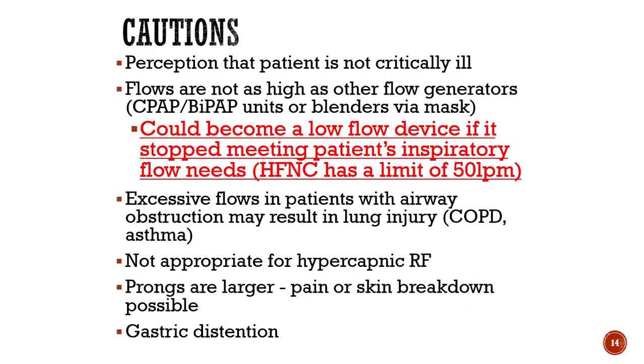Whenever you have patients that are needing high flow blender devices, you always want to be doing some sort of supplementary treatment, hyperinflation, mucus clearance, whatever the case may be. This is not going to cure your patient. This is just going to help them maintain their oxygenation while you figure out what is going on.